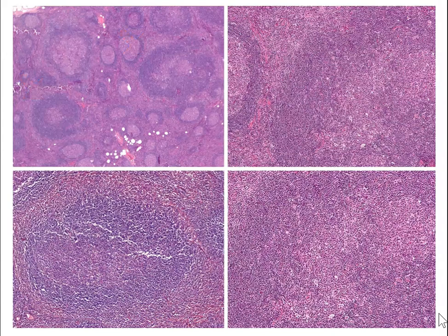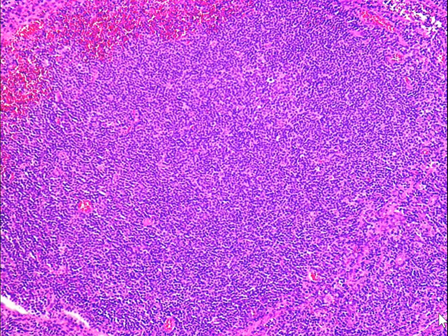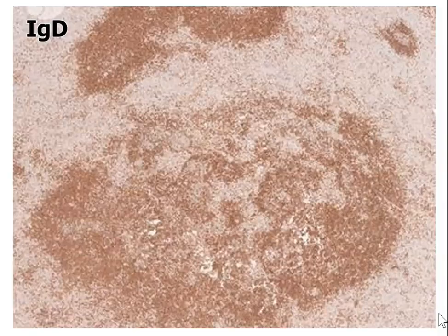Over time, the mantle zone is no longer distinct, and the centroblasts of the germinal centers are surrounded by small mantle zone B cells. In this view, the lymphoid follicle appears as a nodule of mainly small lymphocytes without a clear mantle zone and distinct germinal centers.